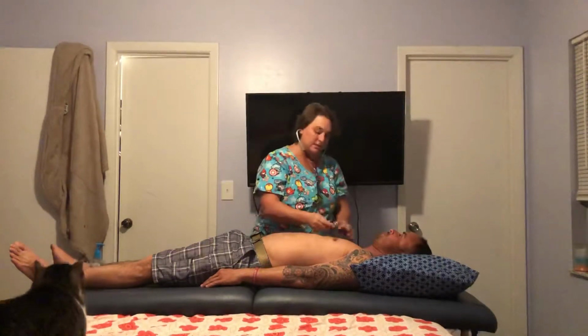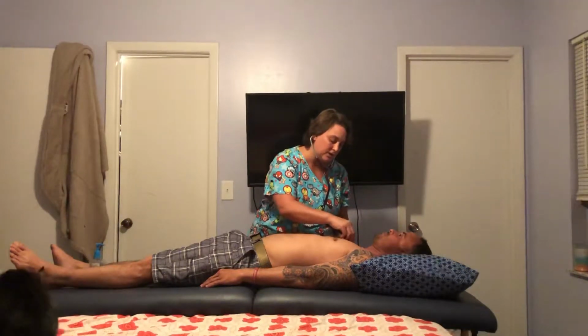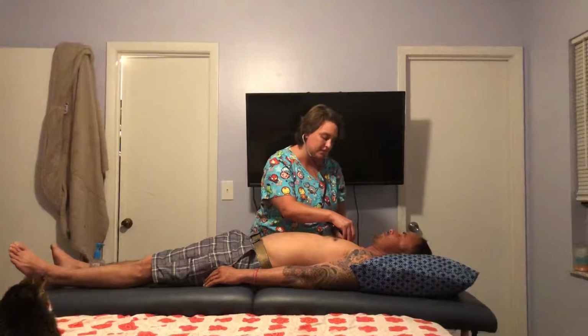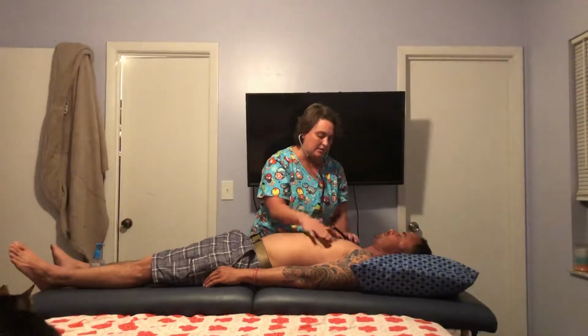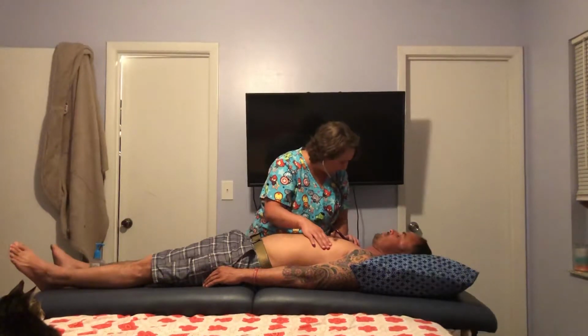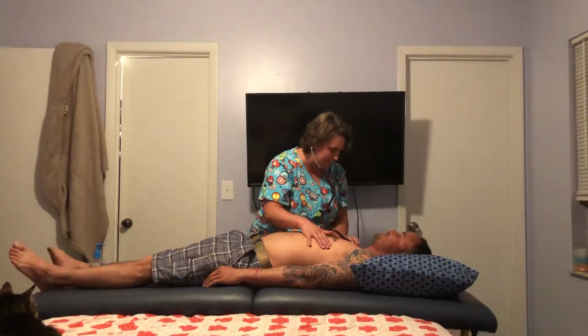Now we're going to listen with the diaphragm. We should hear good S1 and S2 sounds at all of the points. At your aortic valve, S2 should be louder, and as we get over here to your mitral valve, did I say S2 the first time or S1 the first time?